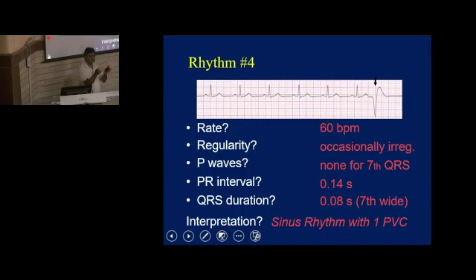So there is only an abnormal QRS complex, because the QRS complex is due to ventricular depolarization, isn't it? Here the focus is abnormal. It is not coming from the SA node. It is generated somewhere in the ventricles only, so it will give an abnormal QRS complex. And then the rhythm will be reset, and again the ECG will be normal.